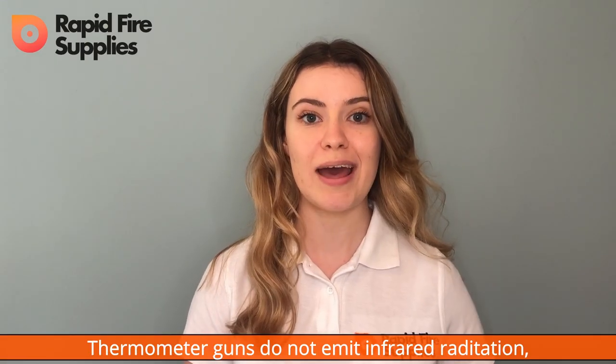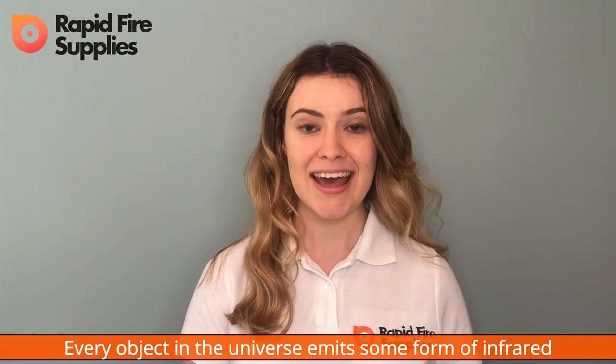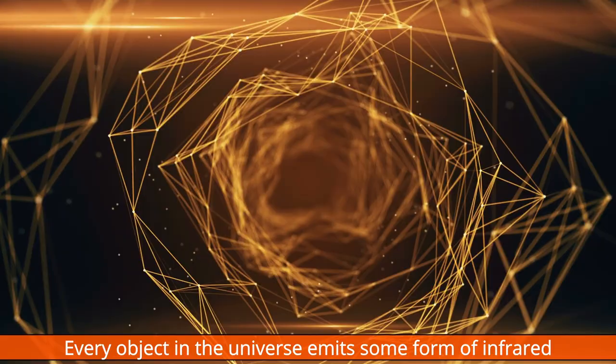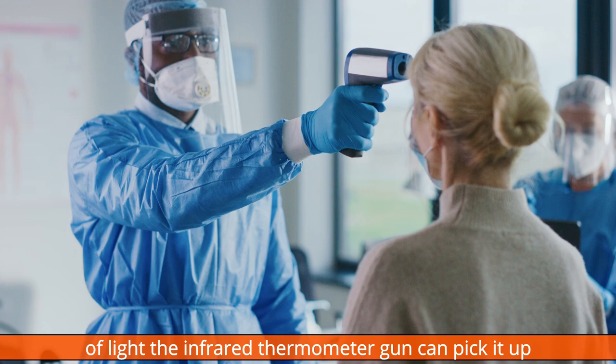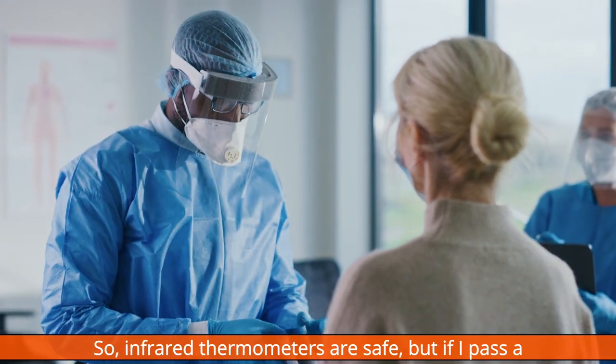Thermometer guns do not emit infrared radiation — they read the infrared radiation that we emit. Every object in the whole entire universe emits some form of infrared radiation. And because this wavelength is different to that of light, the infrared thermometer gun can pick it up and show us the temperature. So infrared thermometers are safe.